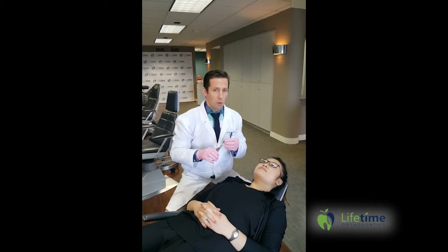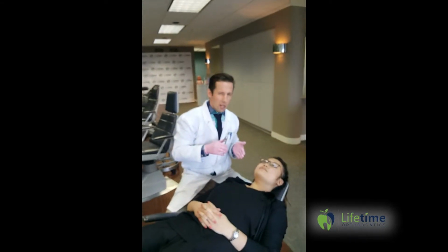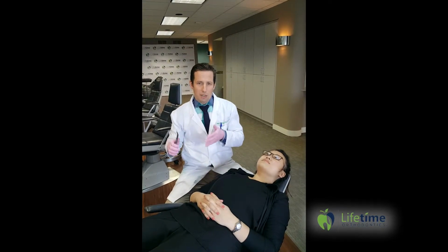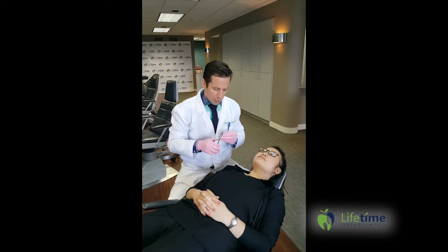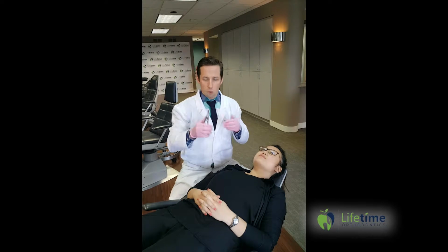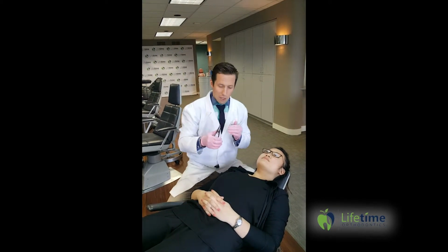Now if it's fallen out maybe a week or two before we have you back, because we usually place a separator and we'll have you back 2 weeks later, sometimes it doesn't always make it that 2 weeks. It's probably okay, give us a call and we can talk you through it, but to save you a trip into the office, here's something that you can do. We're going to give you some floss and some extra separators to take home, so you should have that already.